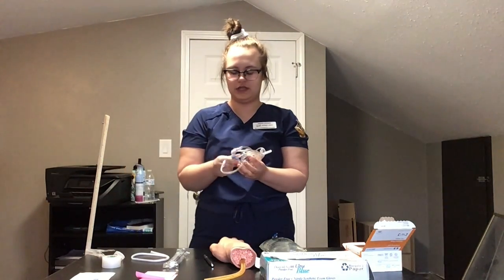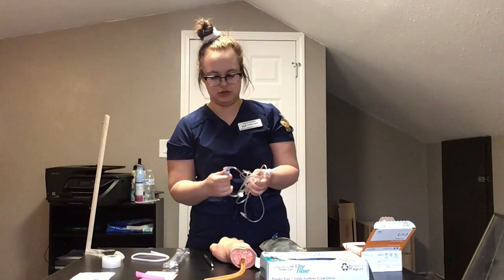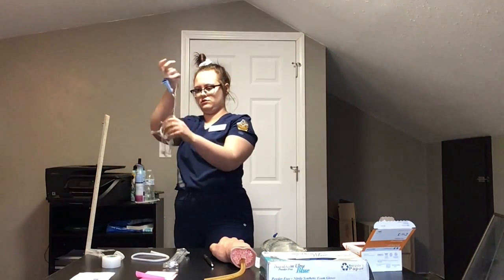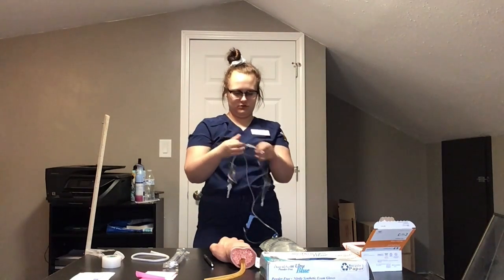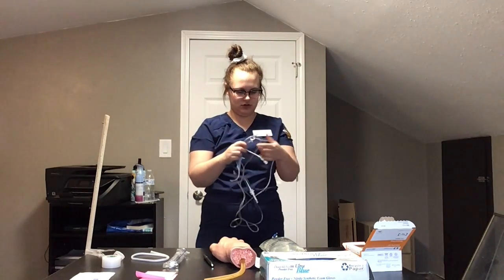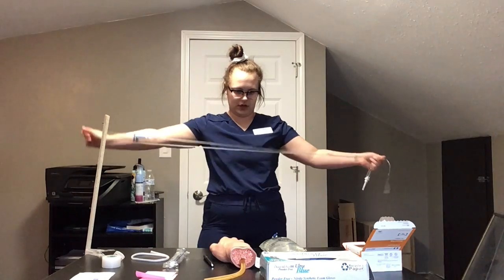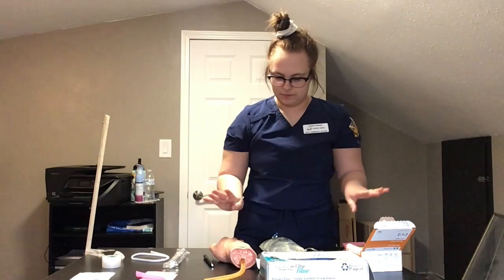And I'm going to make sure that this is locked, and untangle it. Okay, my clamp is locked and the tubing is untied.